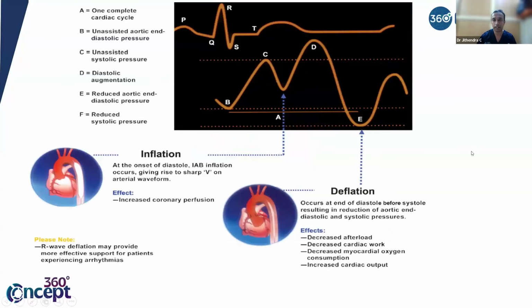So these are the various parts of the arterial waveform. What all are you seeing? The top one is your ECG. Usually the commonly used trigger is your ECG. You set a trigger. We will see what a trigger is. The trigger is what is initiating an inflation and a deflation. What is initiating an inflation is a trigger. The commonly set trigger is your ECG waveform.